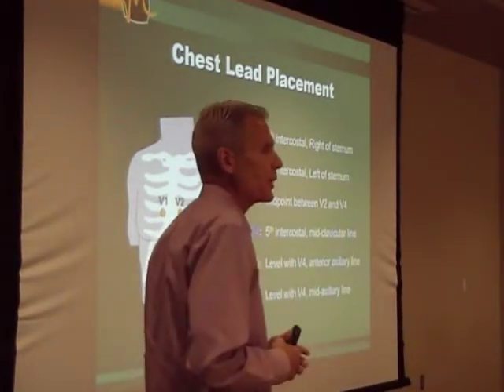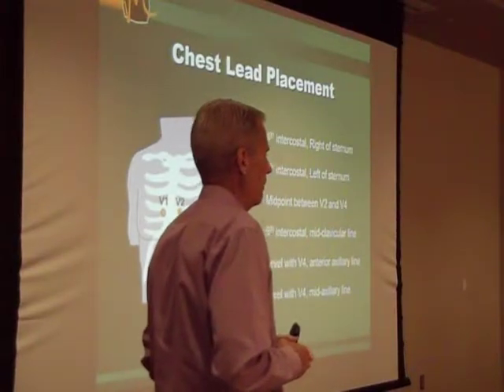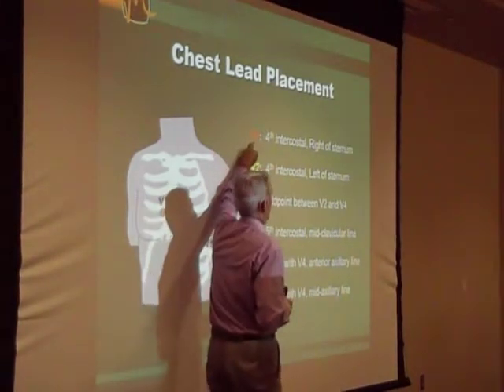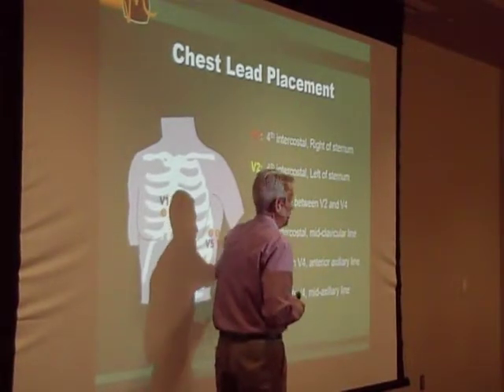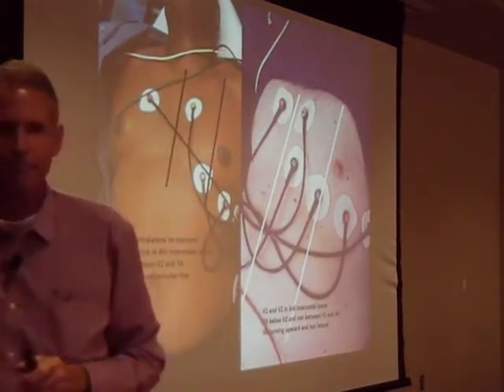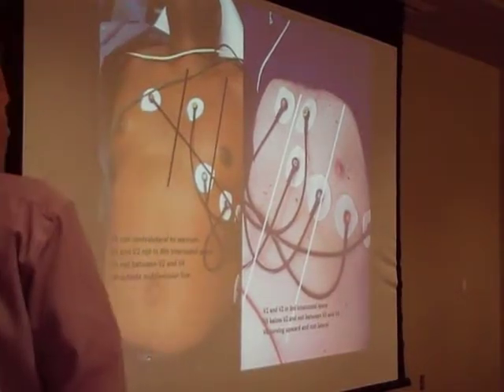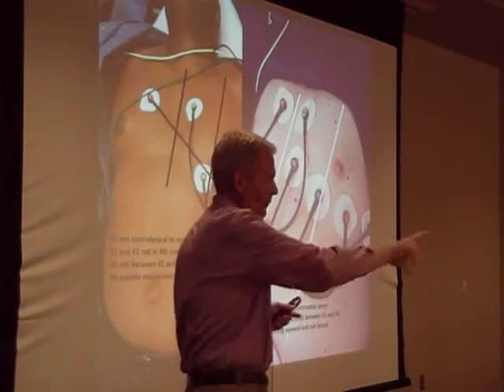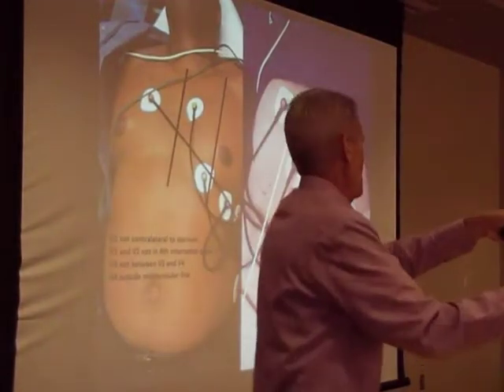How many of you have this committed to memory as far as where your patches go? I think you all know that V1 and V2 have very specific spots. So does V4, and then we kind of fill in the others. Here's my major problem. Years ago, we had toyed with the idea of going to what I'll just call a unipatch. It's a strip that has all your patches in it that we would universally put on a patient and get the patches in the right place.